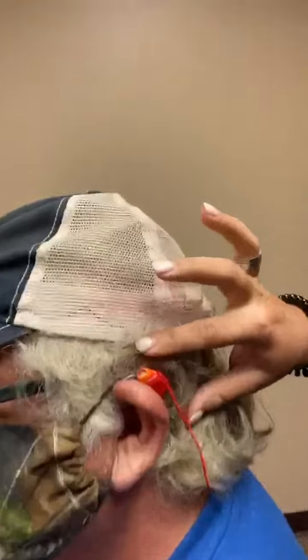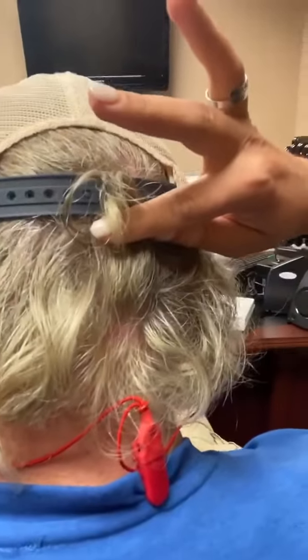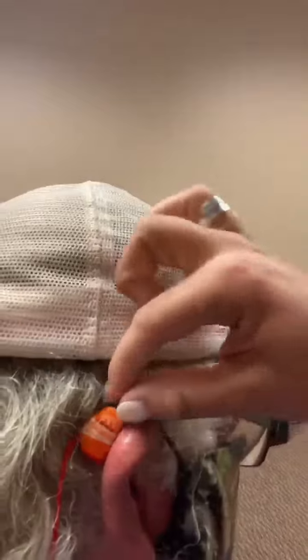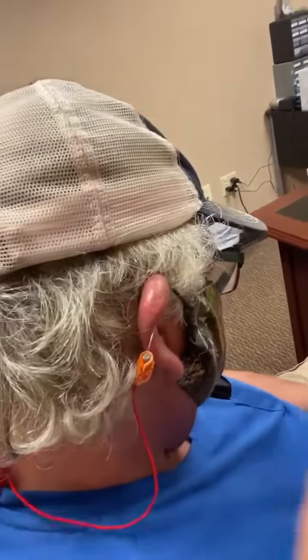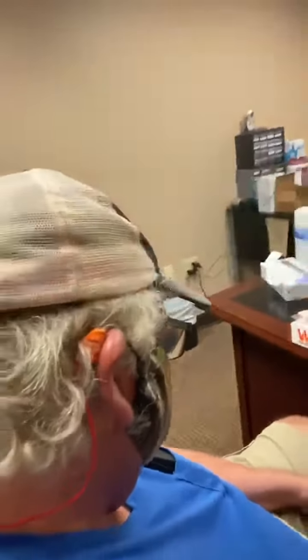What you do is put them on top inside the hearing aid. There's a little wire that snakes around and a clip you put in the back, and then it goes to the other side of the ear. So when you're trying to take off the mask and the hearing aid falls off, this little piece is connected and the hearing aids will not be lost.